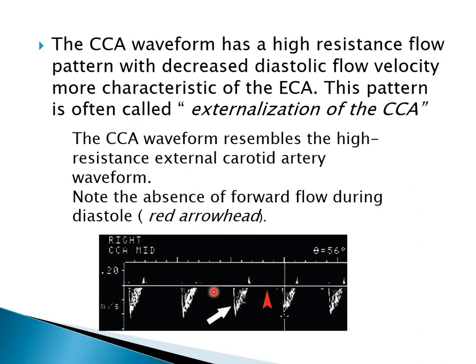Here we have a systolic peak and there is no flow, and also you have reversal. This picture is seen in the complete occlusion of the internal carotid artery. The internal is completely occluded, so there's no flow in diastole at all. And even in systole, the blood just goes, hits the occlusion, and goes back. Hits the occlusion, goes back. Hits with no flow, it's occluded. So you have this appearance.